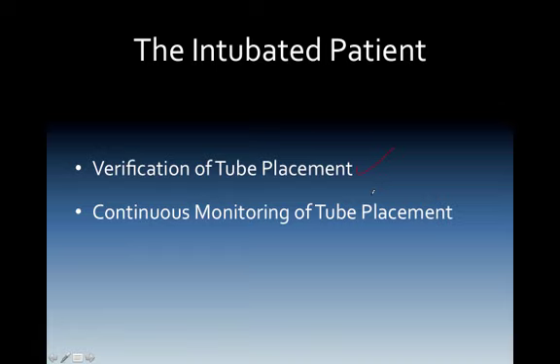So if all of a sudden we had a great capnographic waveform and good numbers, and then all of a sudden it just drops off the face of the earth, there's a good chance that either we have mucus plugging, one, or two, we might actually have extubated the patient.